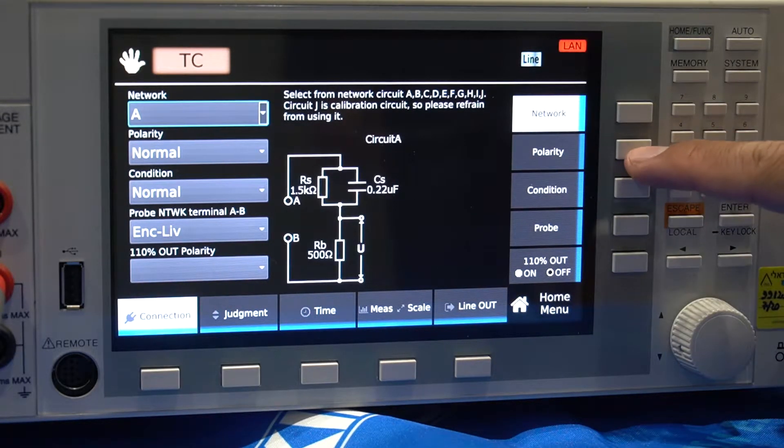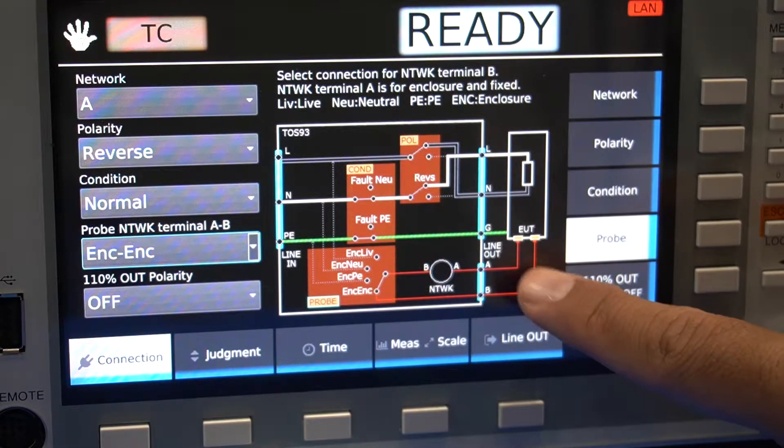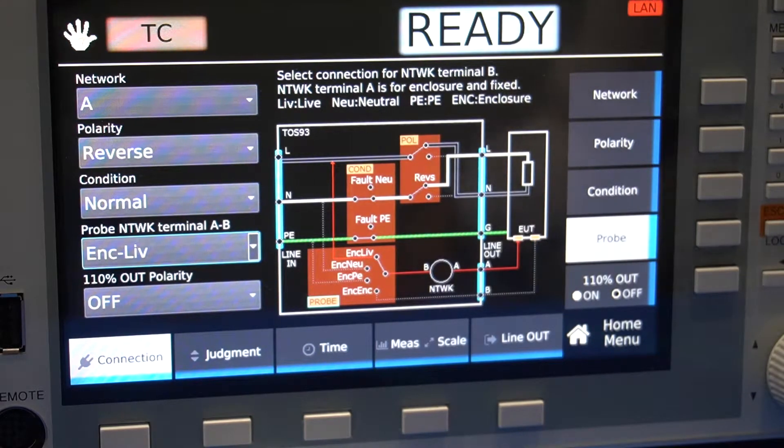You can select the polarity as well. You can toggle through fault conditions as well as probe networks. If both line-outs are highlighted in red, you require two probes; if not, one is fine. For this test, we selected Enclosure Live Network Terminal, which requires only one probe.